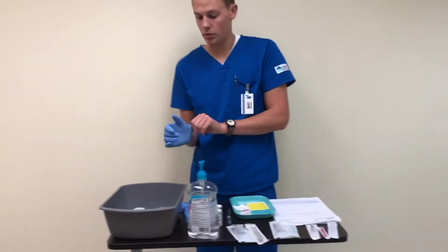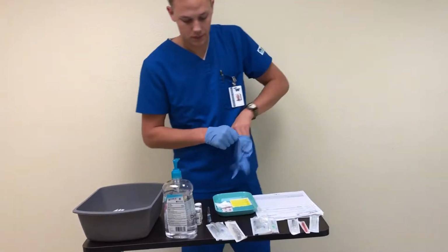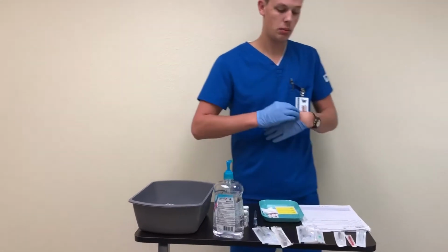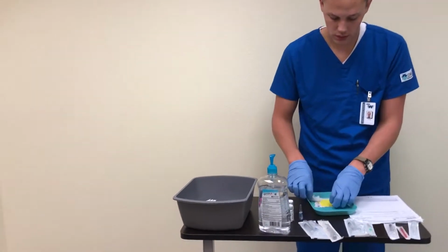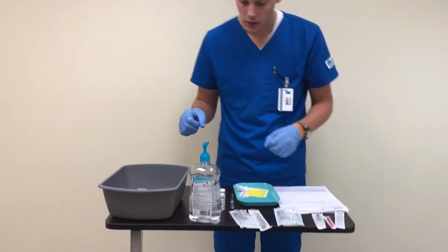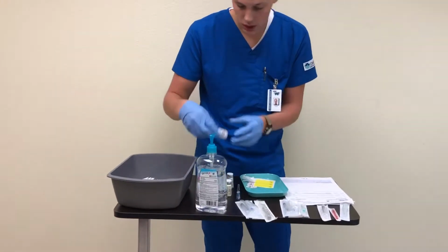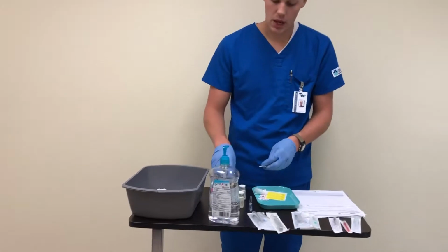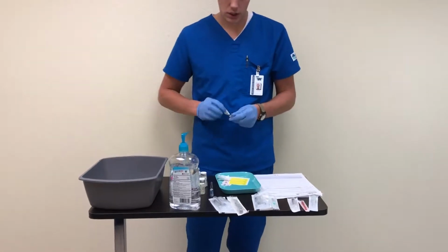So here's just the tray that I'm going to be bringing into the patient's room with me with the medications on it. And I have my labels, a Band-Aid, and gauze, which I'll be needing in the patient's room as well. So I'll just set those to this side. And I can start with my PPD. Let's see here, make sure I got the right ones. So there's my PPD, and there is my sterile water, and I'm going to start by uncapping those and wiping them down with an alcohol swab for 10 to 15 seconds just to disinfect.